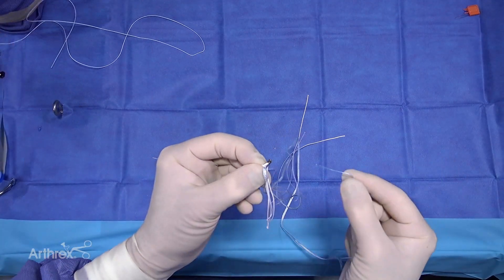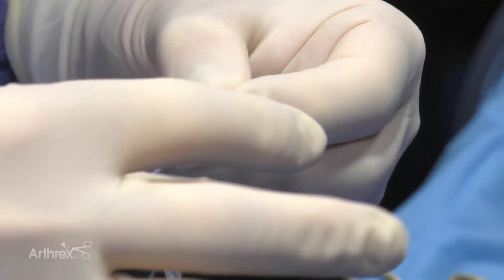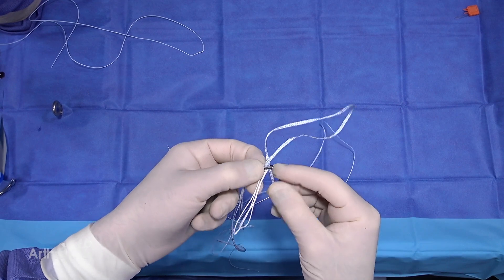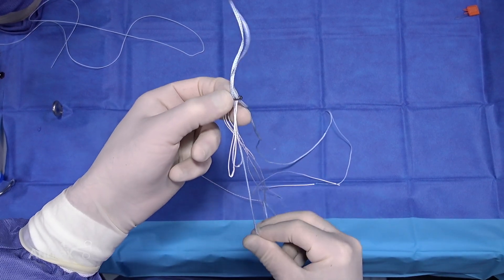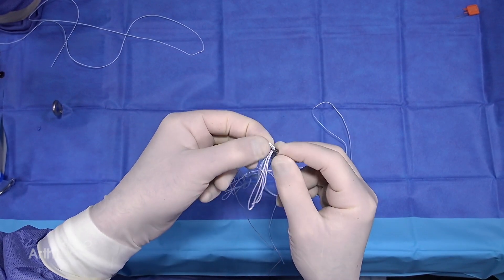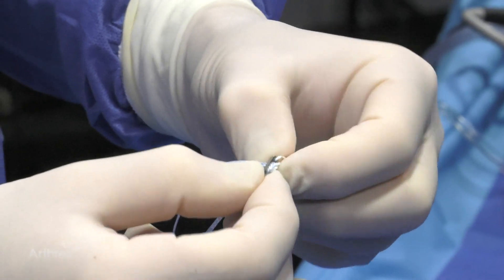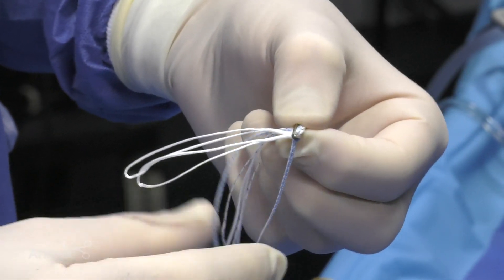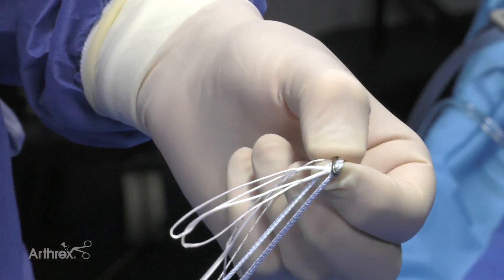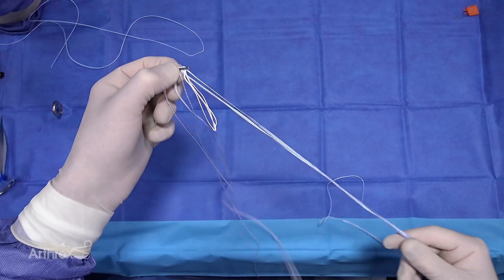Take the other stiff end, which is much easier through the vacated hole from the passing suture that we removed. Then we're going to even out the tapes. Now we have our independent internal brace passed through the femoral suspensory tightrope fixation button, and the free ends will be on the tibial side.